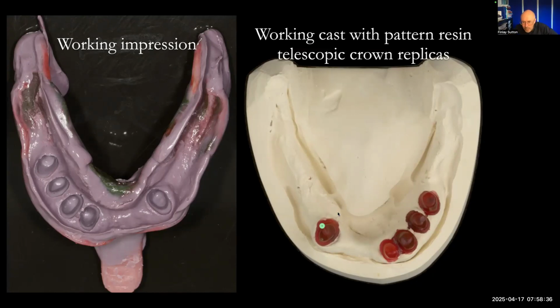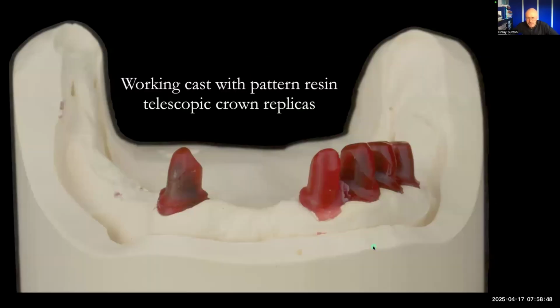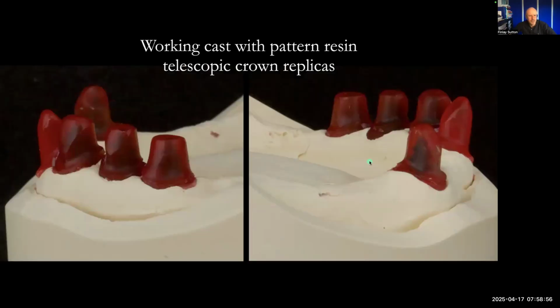And this model gets poured, and Rowan did this with these with Duralay. It was either Duralay or GC pattern resin. He poured those, so that means that these are quite resistant to abrasion, and then we can make the gold work to fit over the top of those later.